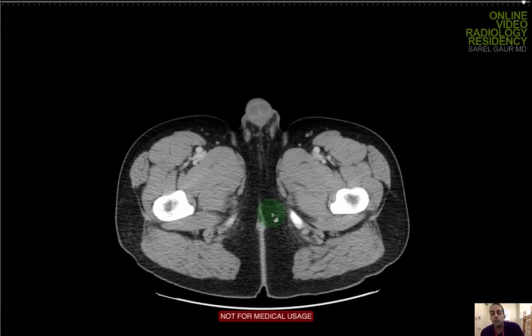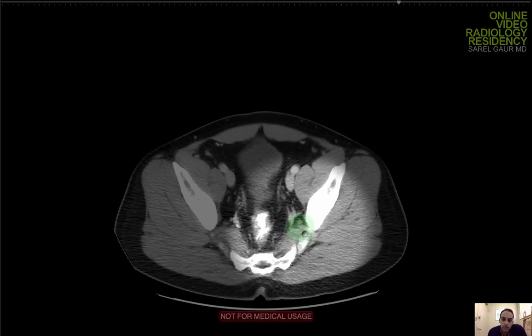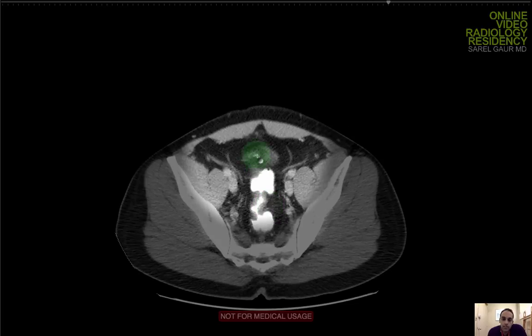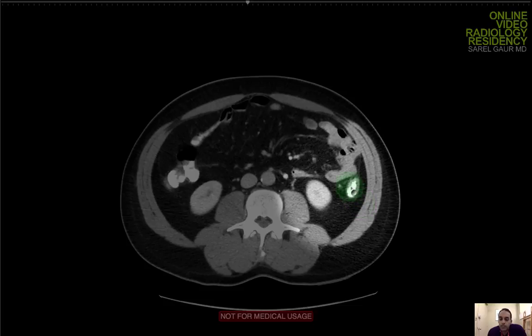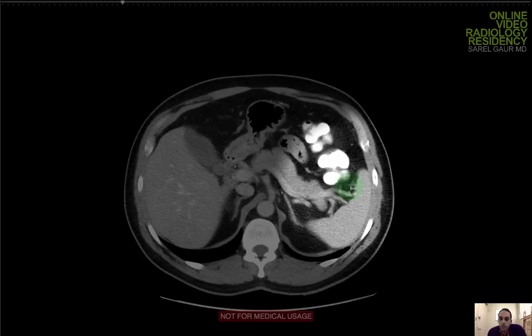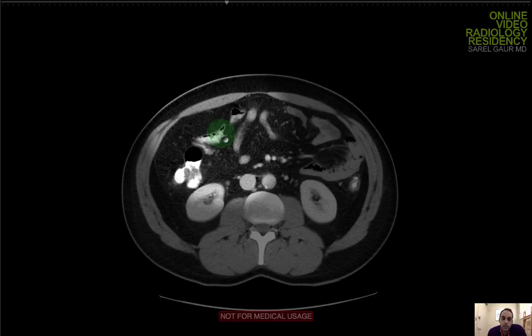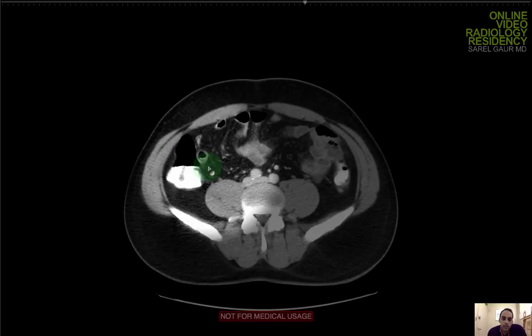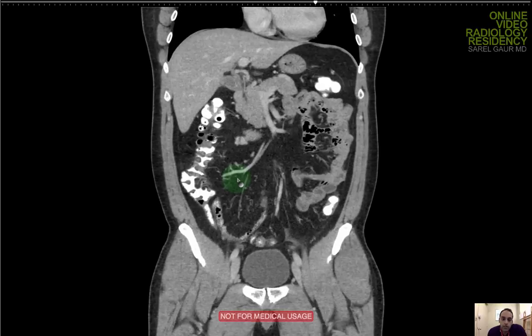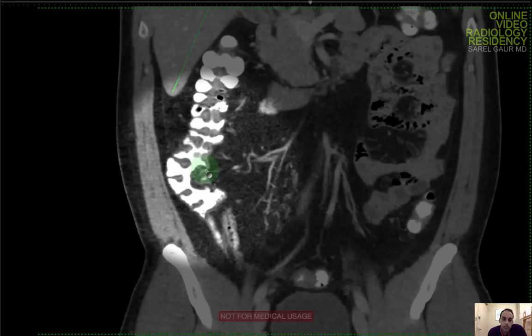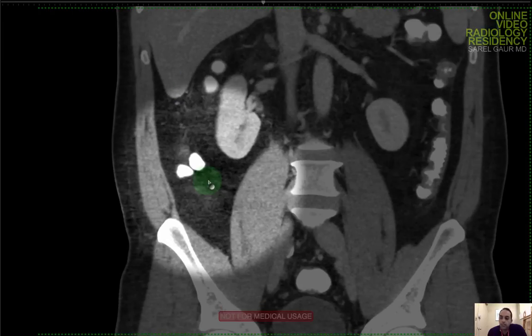Now I'm basically done with the solid organs. I'm going to do the hollow viscera. Coming up from the anus: here's the rectum in a presacral location with contrast visible. At the level of the sigmoid colon — it's on a mesentery so it comes in and out of the plane. Following it into the descending colon on the left side of the abdomen, then the transverse colon. Looking for thickening, colitis, or inflammation — not seeing any. Down to the ascending colon, then going to coronal reformats to find the terminal ileum. Here is the terminal ileum inserting into the colon, with the fibrofatty lips of the ileocecal valve nicely visible. The colon is unremarkable — no thickening, no evidence of obstruction. The appendix is not seen; the patient may have had an appendectomy.